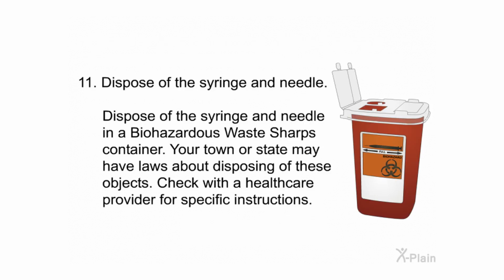11. Dispose of the syringe and needle. Dispose of the syringe and needle in a biohazardous waste sharps container. Your town or state may have laws about disposing of these objects. Check with a healthcare provider for specific instructions.